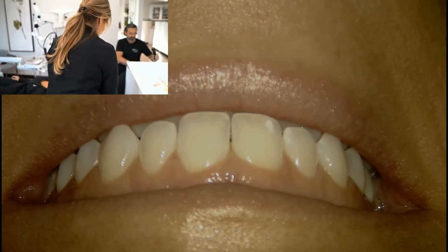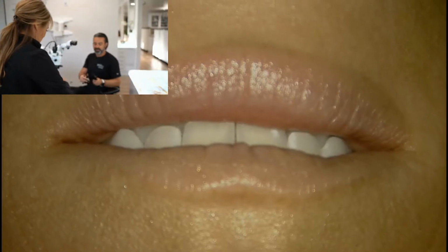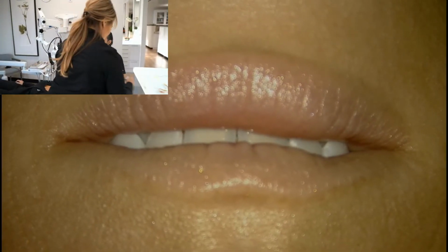All right. So let's just get familiar with just ergonomics a little bit around the mouth and what you can see in the 12 o'clock position.